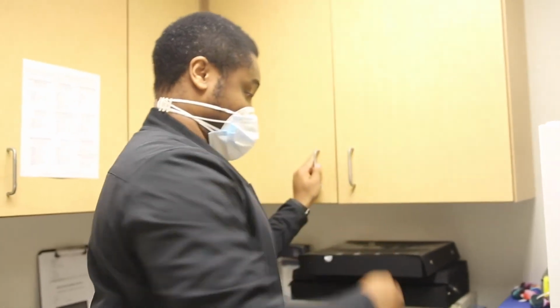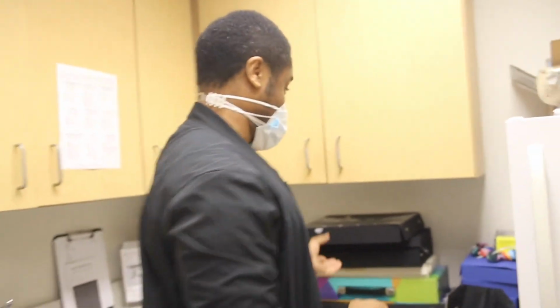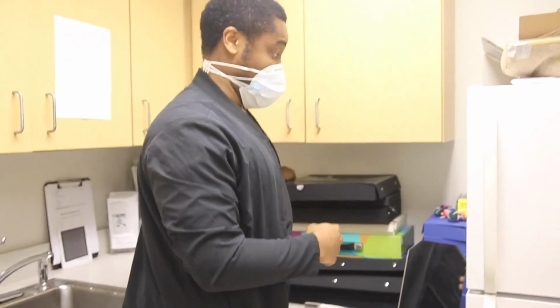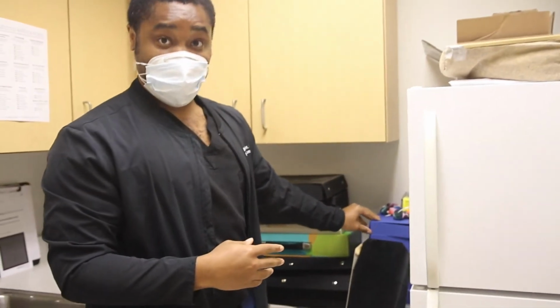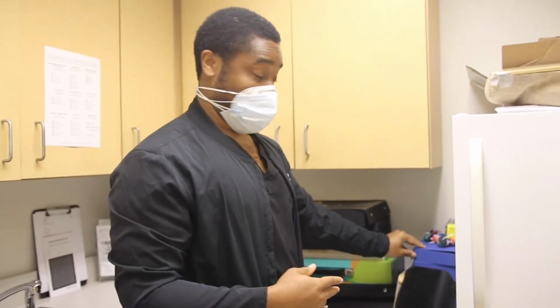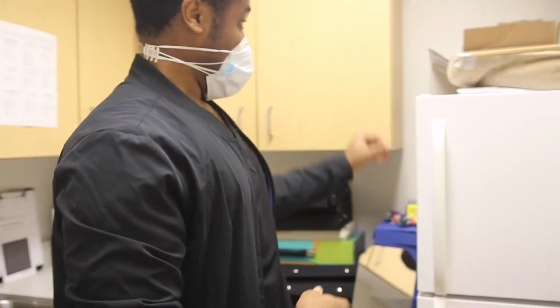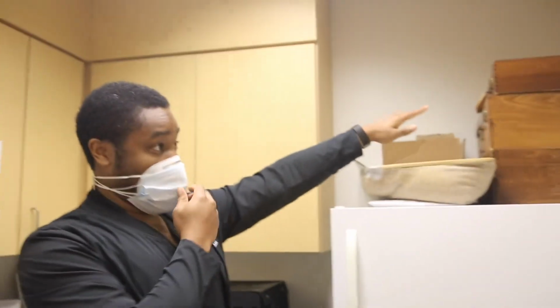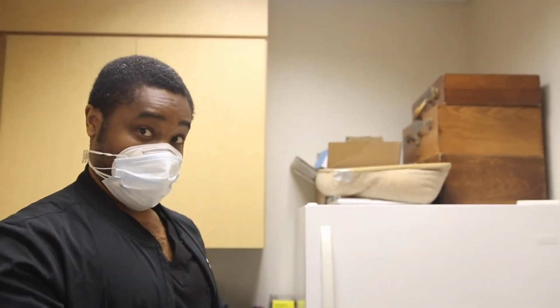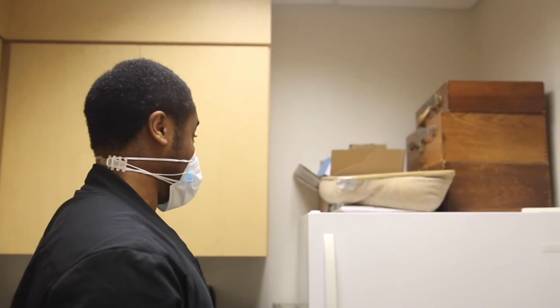If a patient winds up needing glasses dispensed by the low vision department, we actually fit them with a pre-selected set of frames, and we keep those in here as well. Also for children, patients with low vision and many specialty needs, we also fit their glasses as well. And up here we house a couple more low vision devices. We keep a lap desk just in case we need patients to be able to simulate what it's like to read at home. And that is pretty much the rehab kitchen.